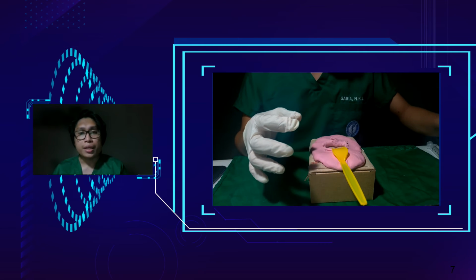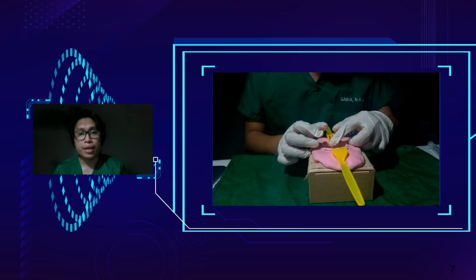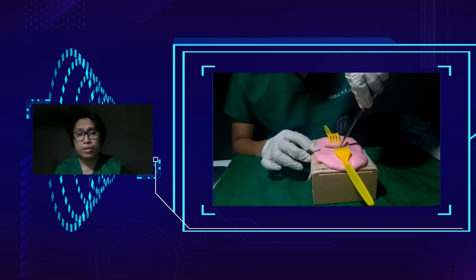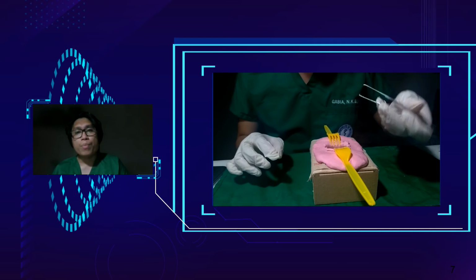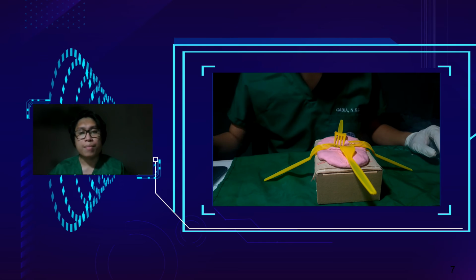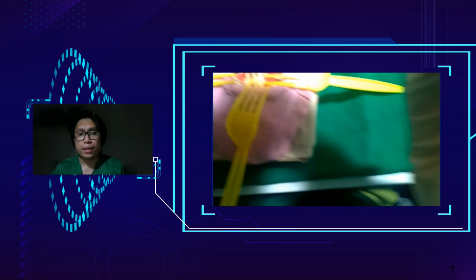Dissect towards the trachea by parting the tissues with scissors, remaining strictly in the midline in a vertical plane to avoid injury to the inferior thyroid veins. Identify the midline cervical fascial plane between the sternohyoid muscles. Divide the intermuscular plane by spreading with a pair of scissors. Repeat this maneuver to separate the sternothyroid muscles and retract the muscles laterally. The trachea and the cricoid can now be palpated.